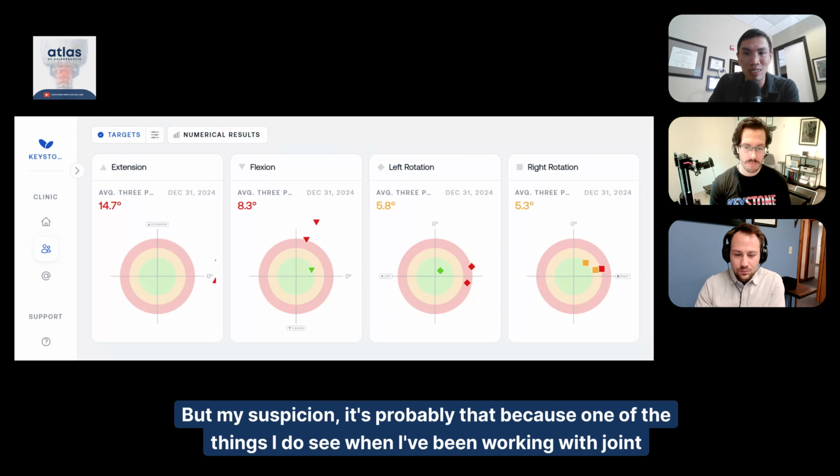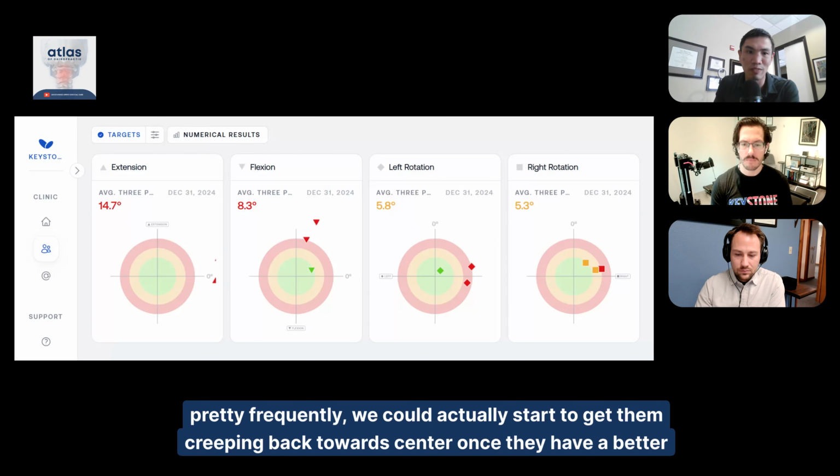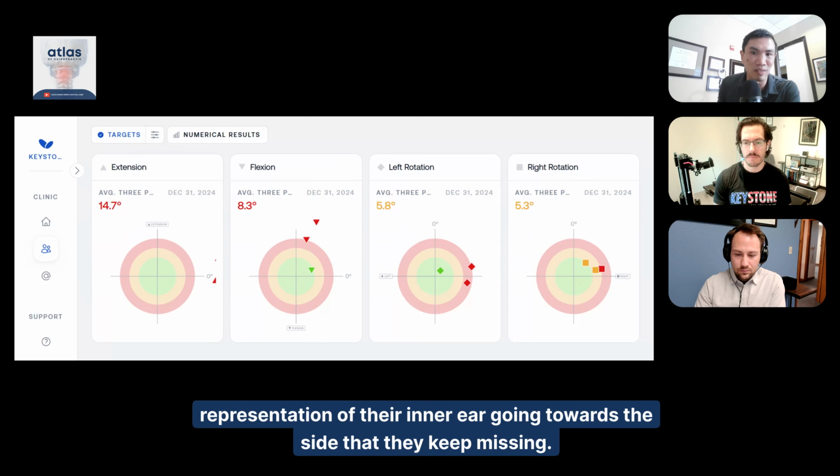Because one of the things I do see when I've been working with joint position error for a while is if I get the person doing head turns towards the side that they miss pretty frequently, we could actually start to get them creeping back towards center once they have a better representation of their inner ear going towards the side that they keep missing.